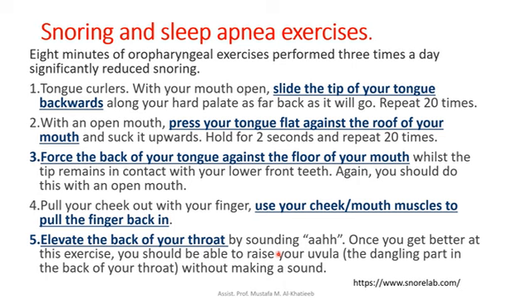Elevate the back of your throat by sounding "ah." Once you get better at this exercise, you should be able to raise your uvula, the dangling part in the back of your throat, without making a sound.